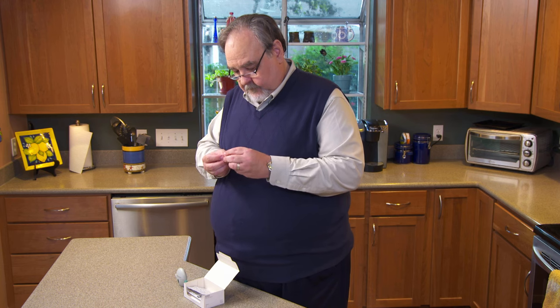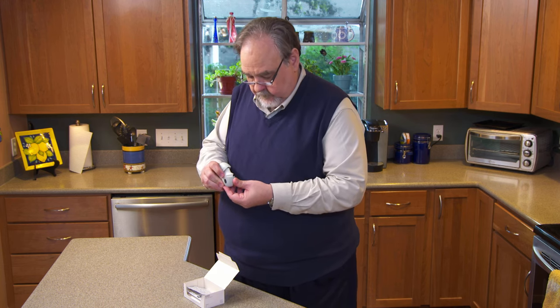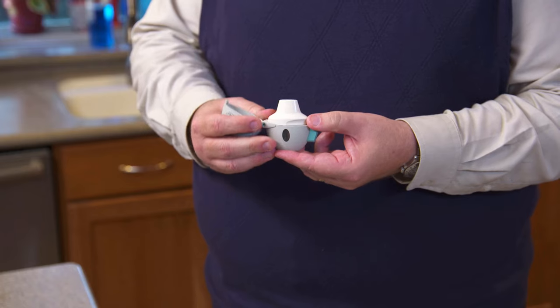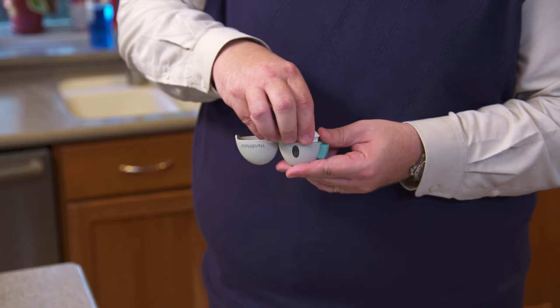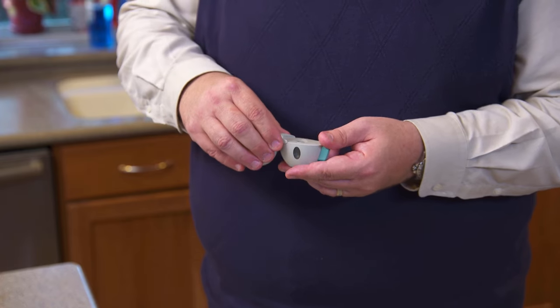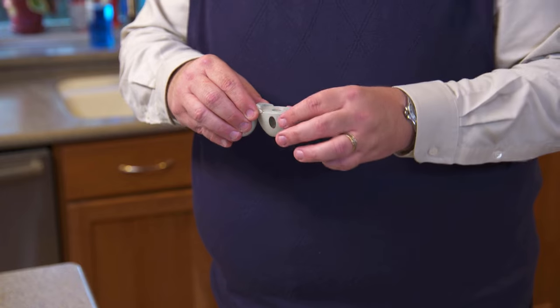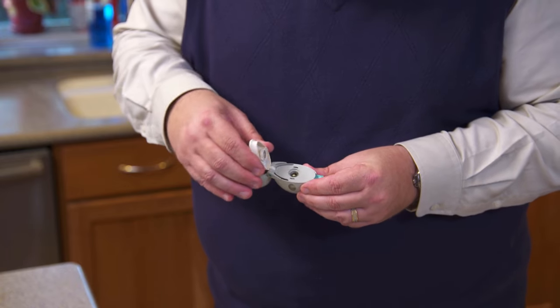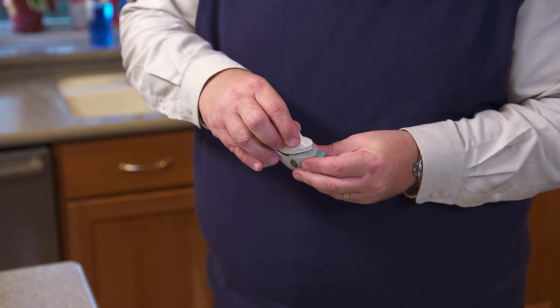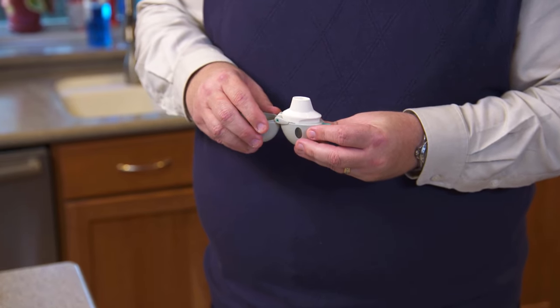Put just one capsule into the HandiHaler. To do this, press the green piercing button — this releases the dust cap. Lift the mouthpiece to reveal the center chamber. Place the medicine capsule in the chamber, then close the mouthpiece. You'll be able to feel and hear a click when the mouthpiece is in place. The dust cap remains open.